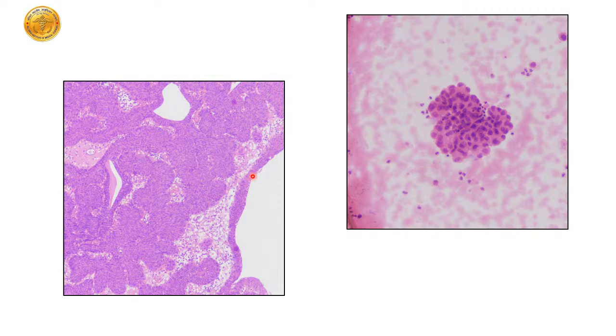So this is the case I showed you, an H&E stain slide, and we call this benign urothelial tissue fragment. There was no fibrovascular core, and there were only occasional fragments with these community borders, what we call papilloid. But there was no fibrovascular core even on going back. And this is what we got on histopathology.